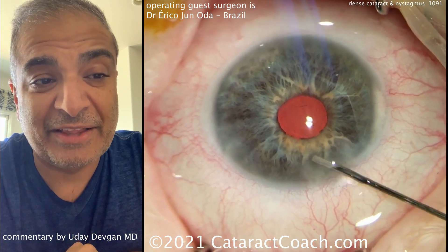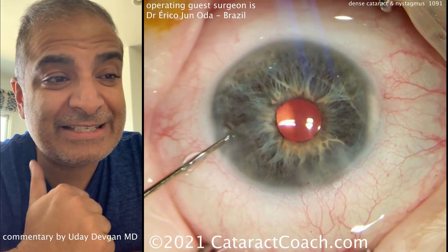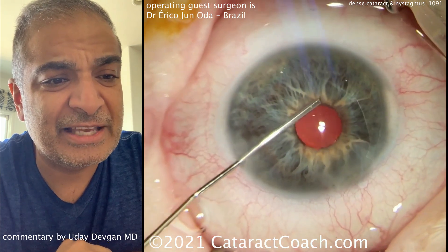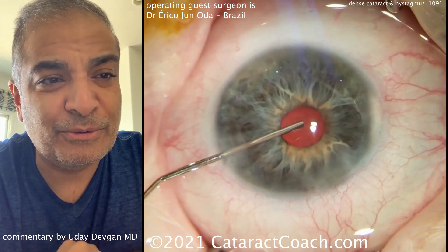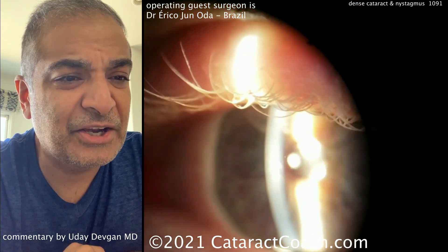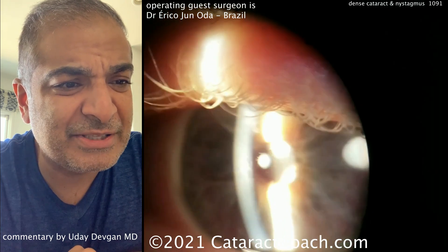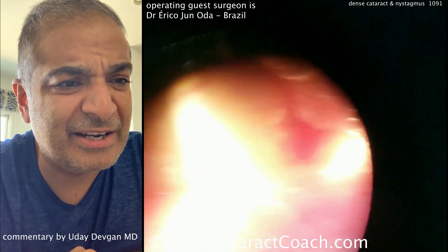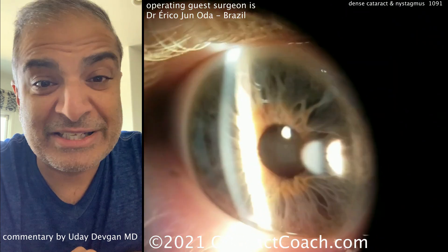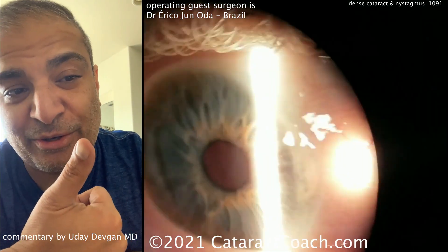That was really well done — that's a tough, tough case, and Dr. Érico Jun Oda from Brazil did a fantastic job. Really liked the technique here. Sealing up the incisions at the end, and let's look at the post-op pics. Make sure that lens is centered. Post-op: the cornea looks pretty good, lens in good position — you can see the nystagmus. Excellent outcome. And let's see the other eye — there's that dense cataract, that one's up next. Thanks for submitting the video; I really enjoyed watching it. Check out CataractCoach.com.